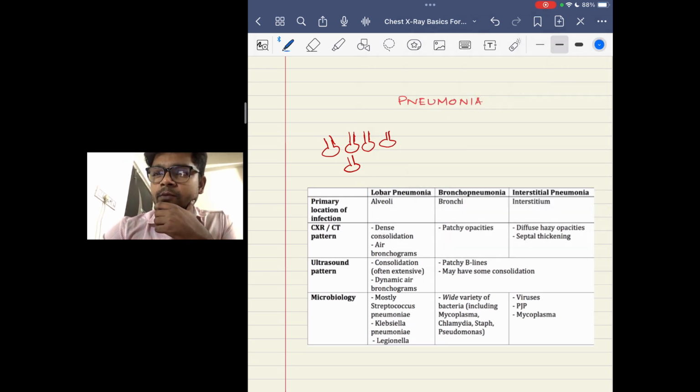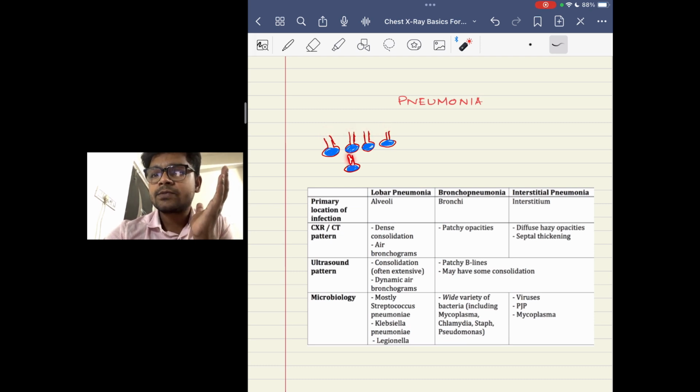And now in pneumonia, there is exudate exactly at this point and in the alveolar sacs. So there are multiple of them. So these are forming a consolidated thing that is appreciated on the X-ray. But notice that the airways are relatively free of any exudate.